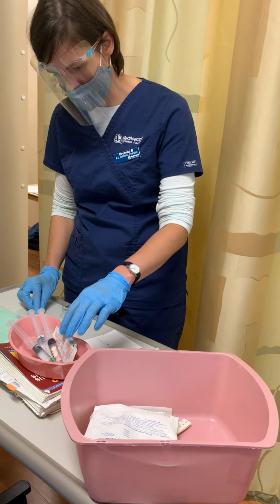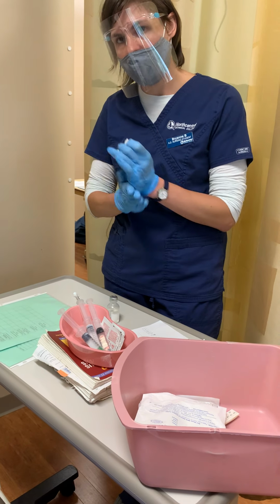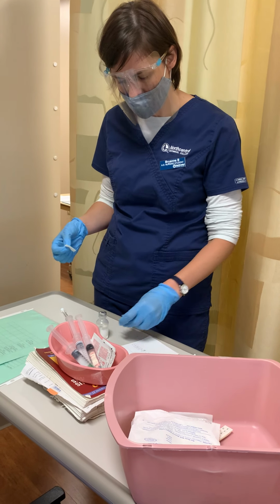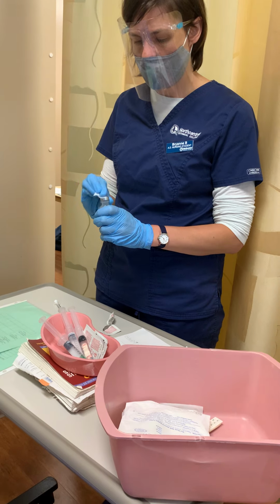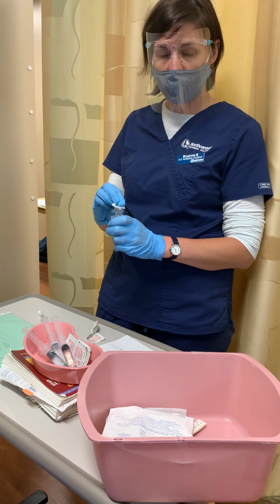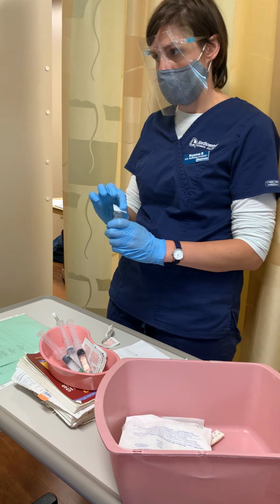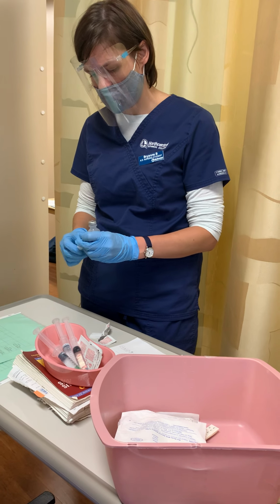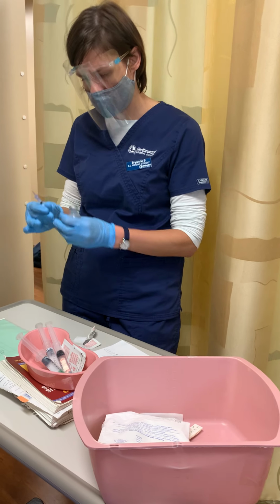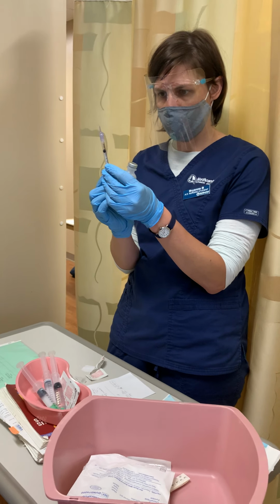So I have my bag. I would probably wash my hands and glove here, just to be cautious. I don't want to infect it at all. Sanitizing, again, facility protocol, 15 seconds. And we'll say that that's the full 15. Now I'm going to let it dry. Got my VAD on there. And again, 0.2 ml. I'm going to draw back.